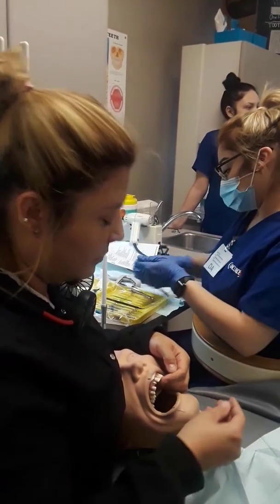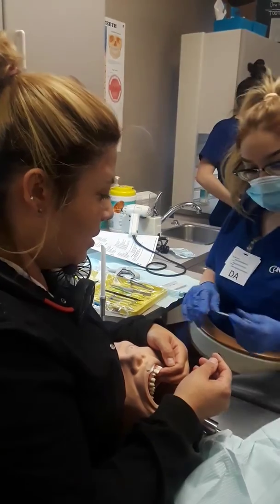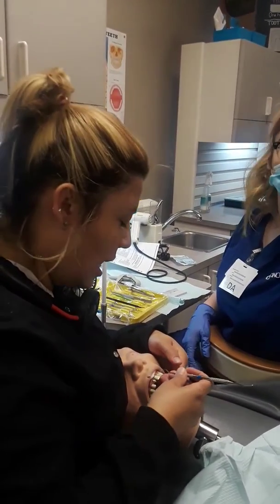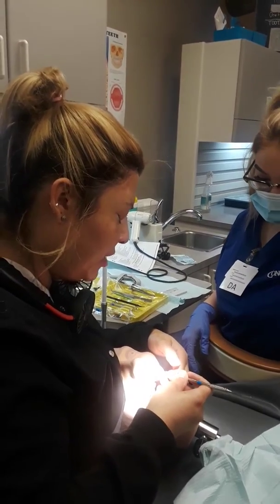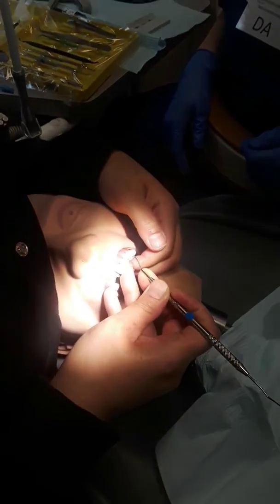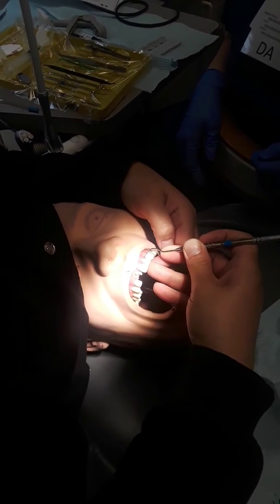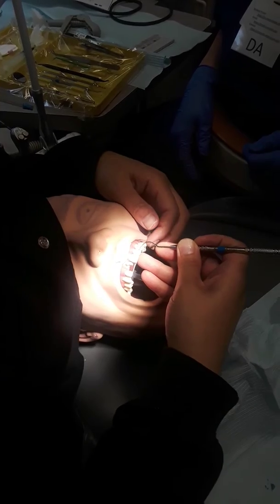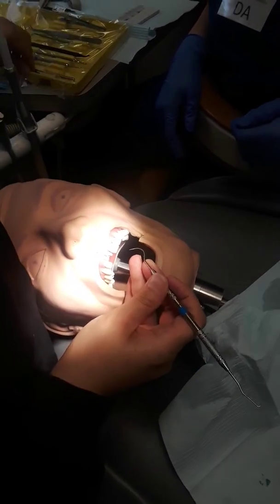She passed the explorer — I'm going to check my filling to make sure everything is intact and see what I need to adjust. I don't want to have to pick this up again, so I need to adjust this because it's a little uneven. Let's check my lingual.